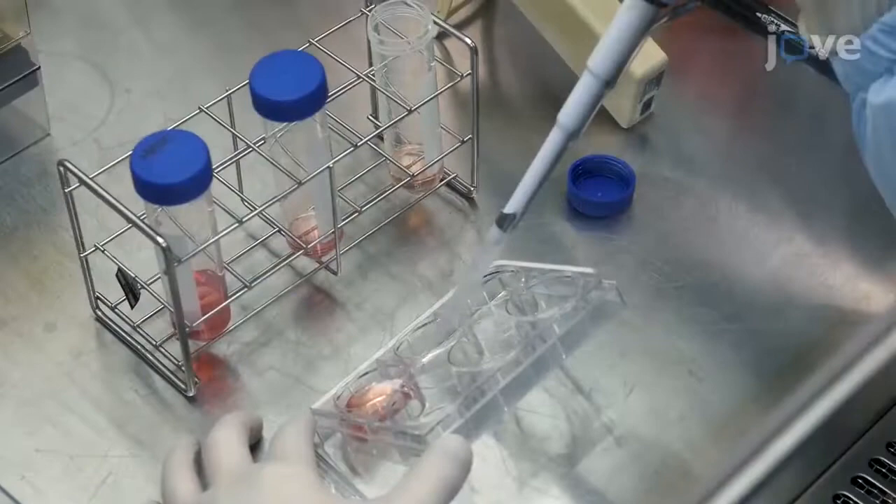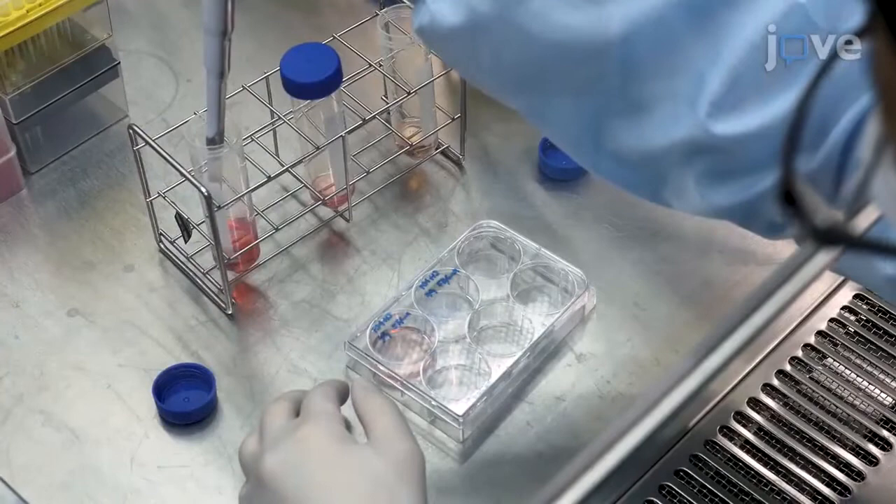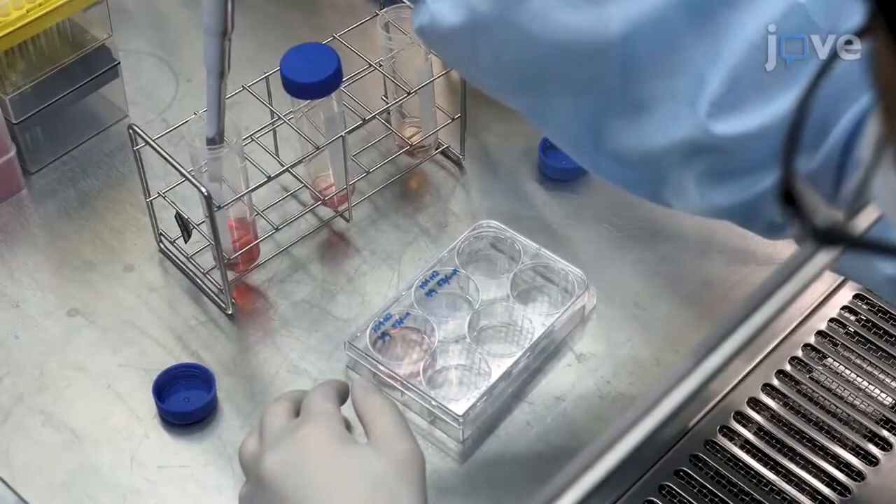After this, aspirate the EDTA from each well. Add 1 mL of HPSC maintenance medium at room temperature supplemented with 10 µM Y27632 to each well.